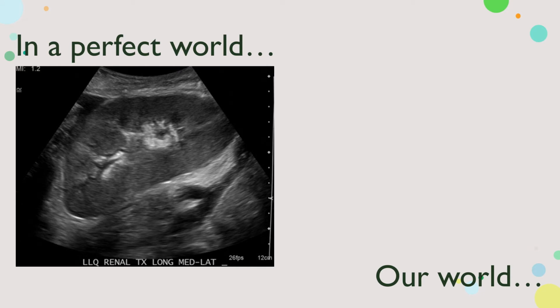Okay, so now that we've covered a little bit of the basics, here's what we're dealing with out in the real world. So in a perfect world, our images would be very high quality, high resolution.